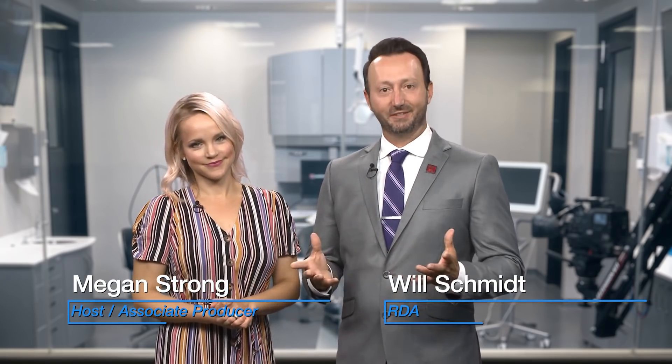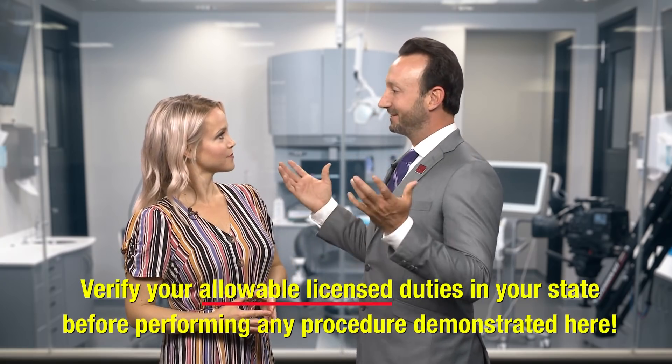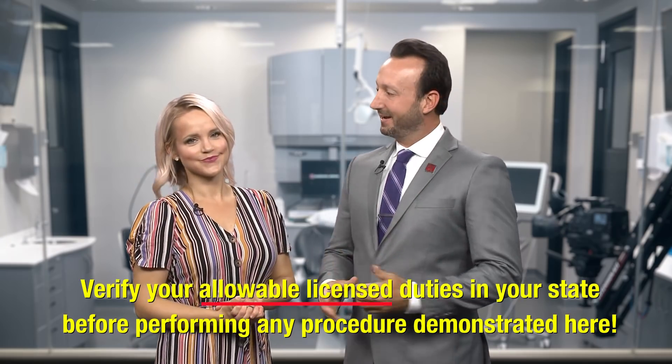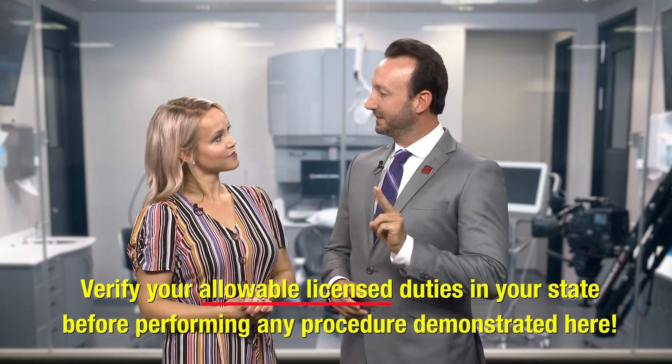Welcome to Chairside Live. I'm Megan Strong and I'm Will Schmidt, registered dental assistant here at Gladwell Dental. In today's episode we're following you from start to finish as you scan a single unit crown prep — it's more of the iTero scan extravaganza. Today I'll be scanning a number 30 crown prep and our doctors are going to show us two different techniques for cord retraction.